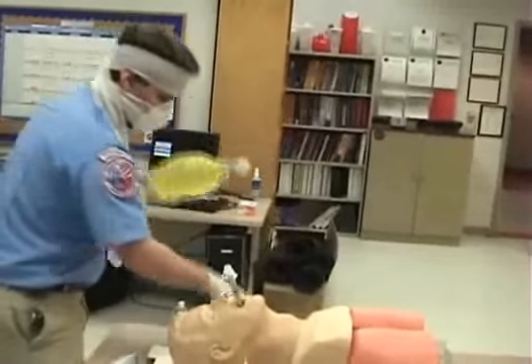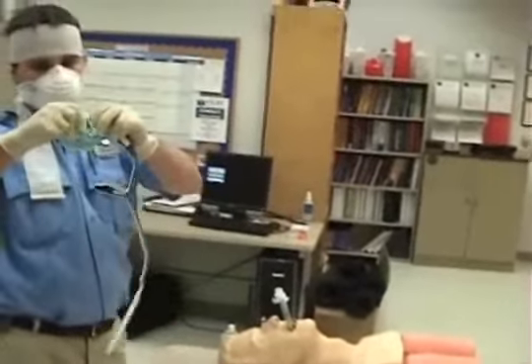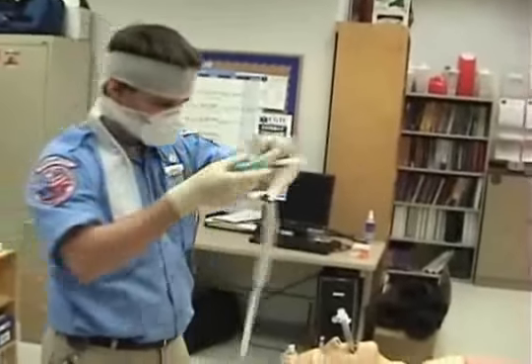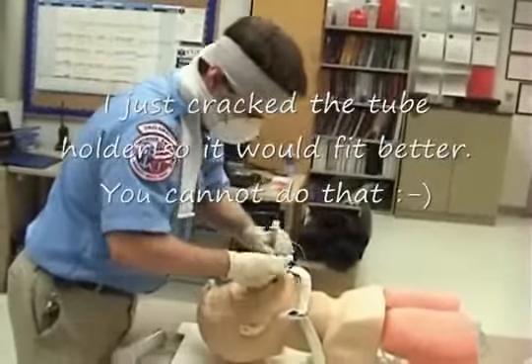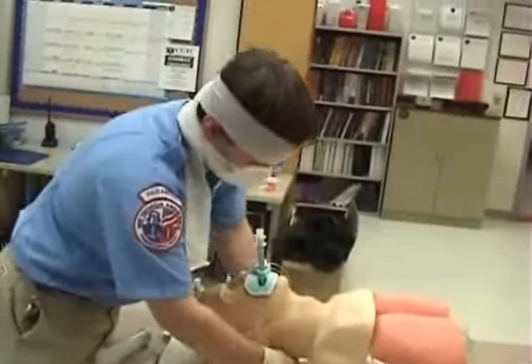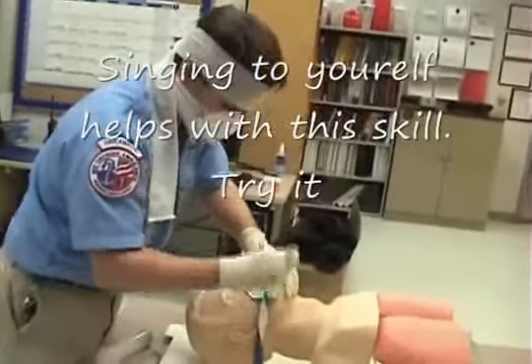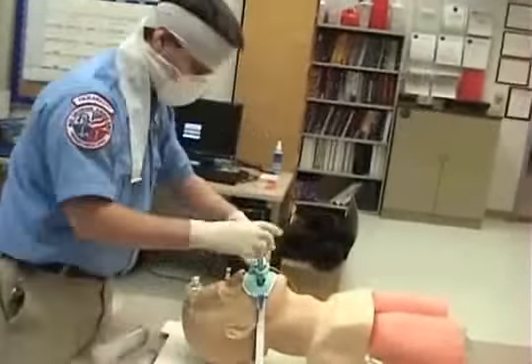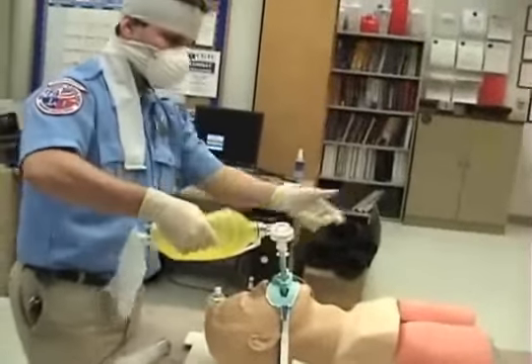Once we know that the tube is properly placed, we're going to take this commercially available tube-holding device, place it around our tube, make sure it's seated well in the patient's mouth, screw that down, and ventilate.